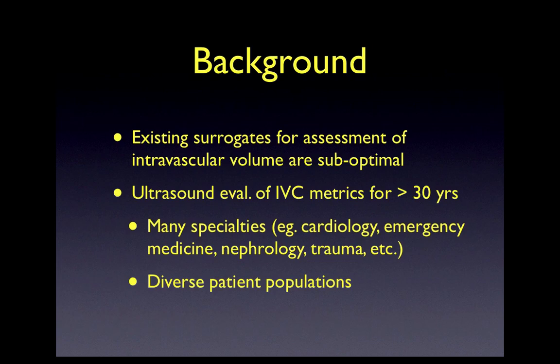As a result of the many different specialties that have employed ultrasound in their clinical practice and in research, the literature is quite diverse, involving many different patient populations. Now, this certainly does make it challenging when one tries to distill the numbers to absolute levels of normal and not normal. When the dust settles, there are clear trends and principles which can be helpful in any clinical arena.